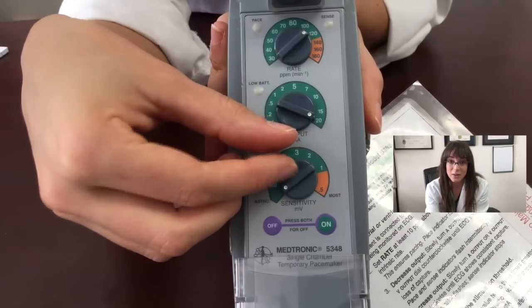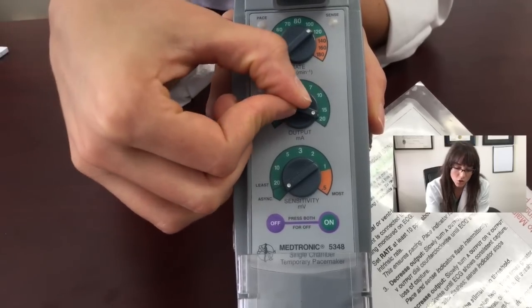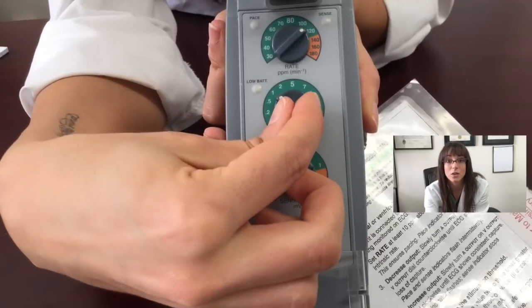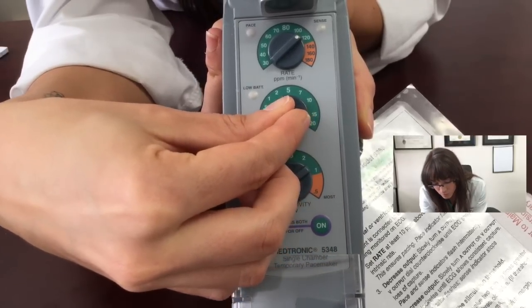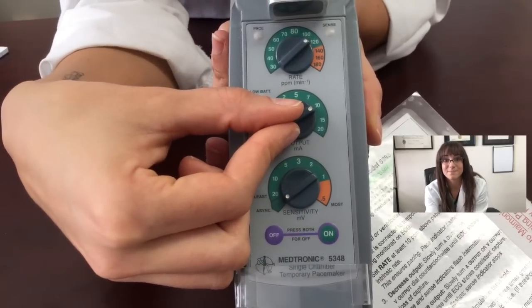Now your pacemaker wire is in place. The last step is working the box. We have the milliamp voltage set at the maximum. Now we want to decrease it to find the optimal voltage. Bring it down while watching the monitor until you completely lose capture. Let's say on this patient you lose capture at 1. Slowly bring it up until you gain capture — let's say you gain capture at 3. You're going to go at about 2 to 3 times that, and that's what you're going to keep your setting at.